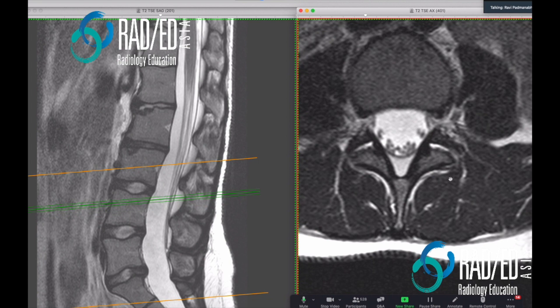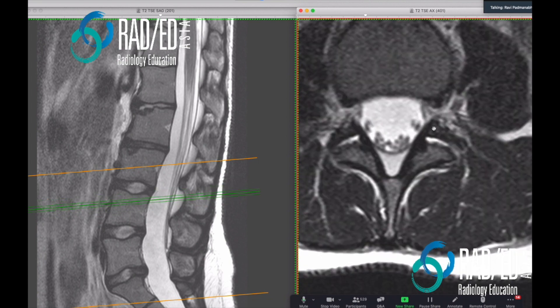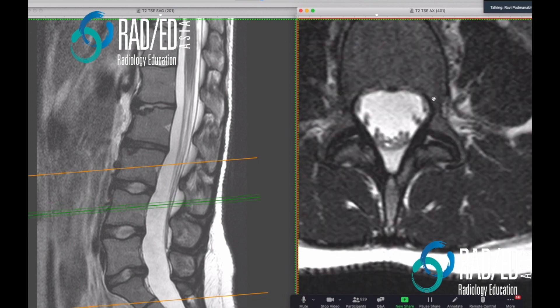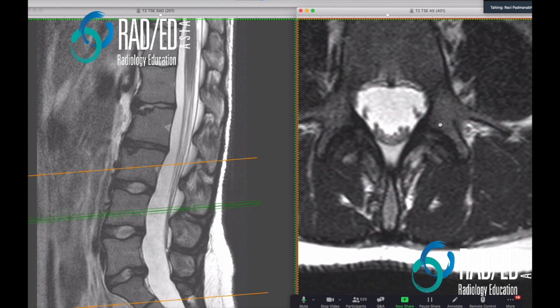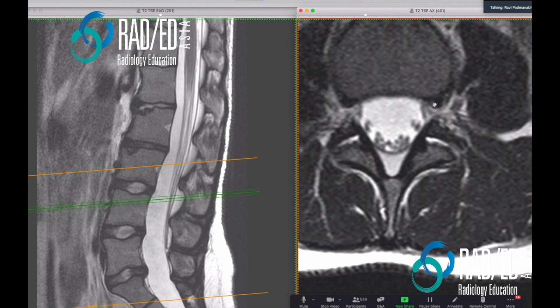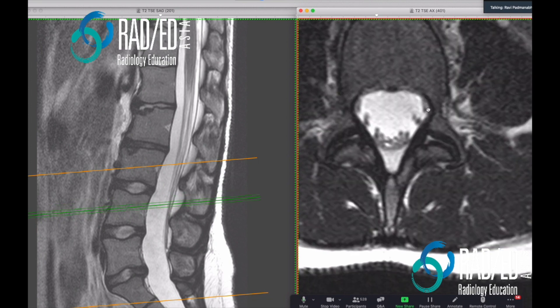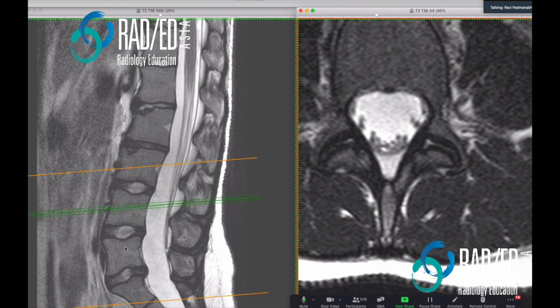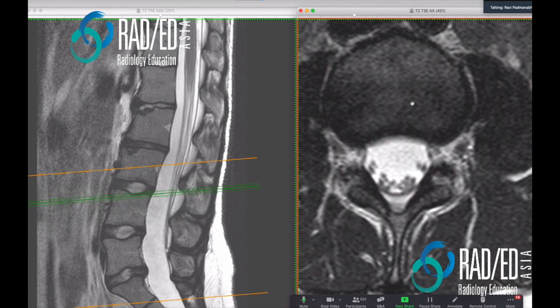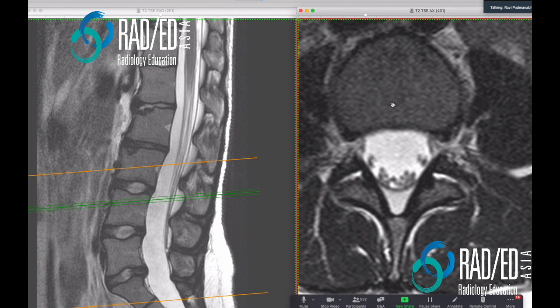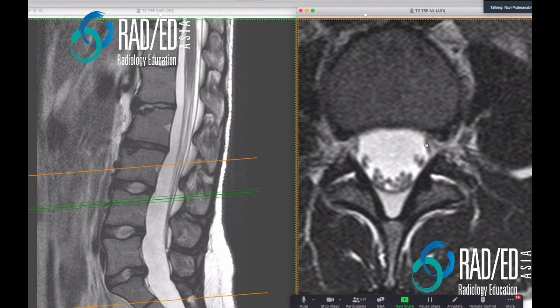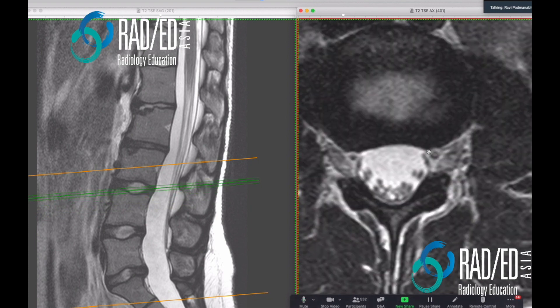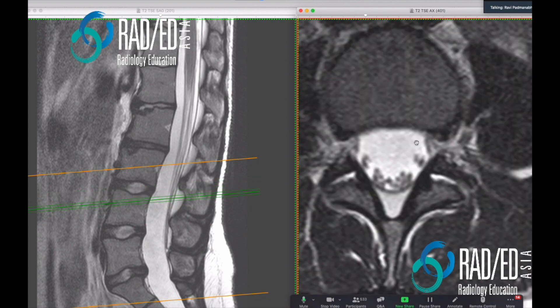What does the subarticular or lateral recess mean and how do you find it? The best anatomical marker is the pedicle — this region next to the pedicle is the subarticular or lateral recess. We have a nerve root that goes in there called the traversing nerve root. At the L3-4 level, we have an exiting nerve root which is L3 and a traversing nerve root which is L4. A cyst sitting within the subarticular lateral recess will affect the traversing nerve root.